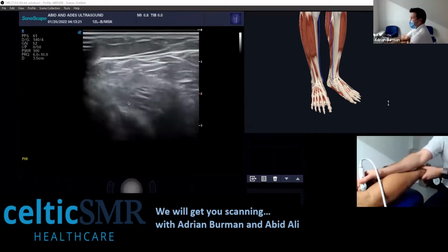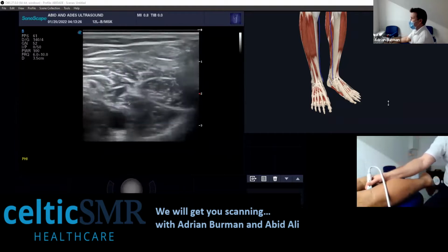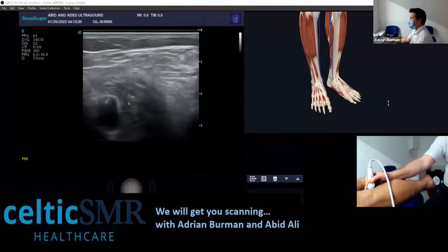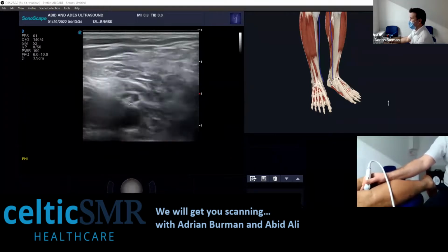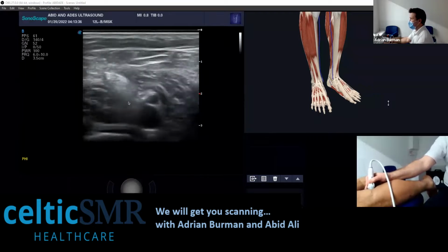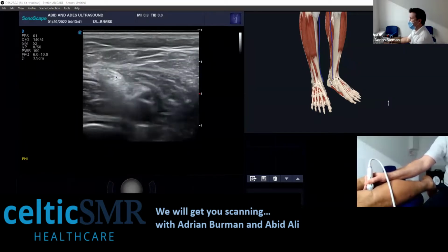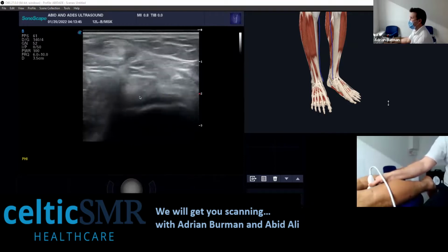You can compress that, make sure that's compressible. Okay, so if you've got a large Baker's cyst, and it's huge, I always tend to try and just interrogate the popliteal vein as well, just to make sure there's no sort of DVT or thrombus or anything in there. It's a bit of nerve here. Other things you can look at.